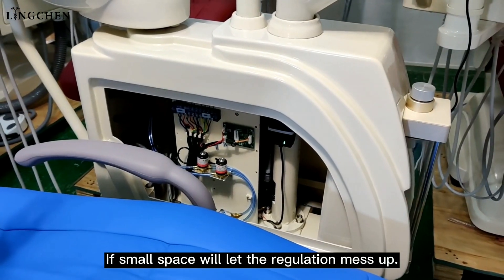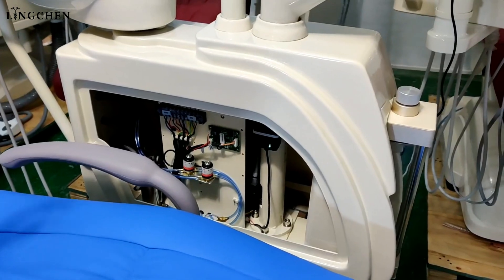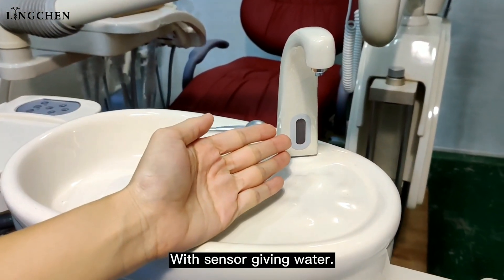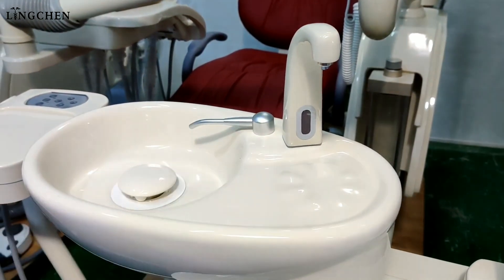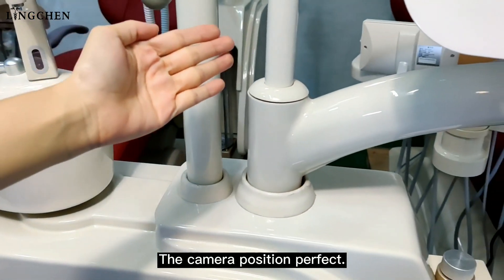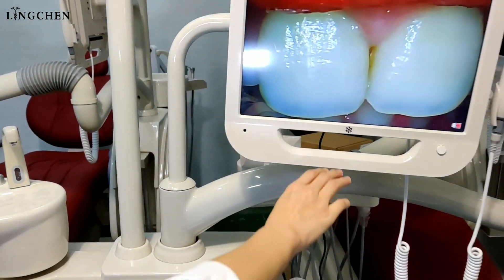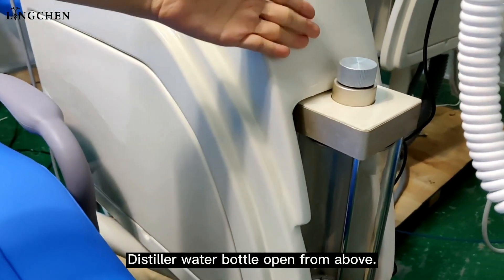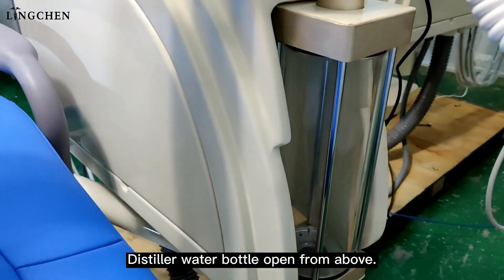The cables and tubes are regulated in a good way — a small space would cause the regulation to become messy. With a sensor for dispensing water, the camera position is perfect.